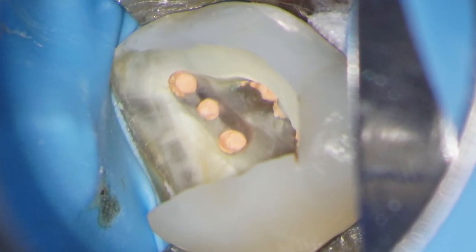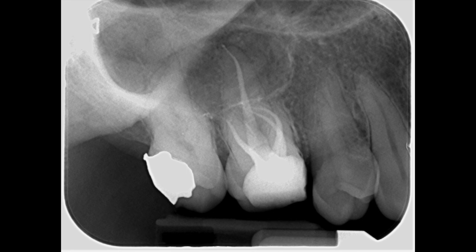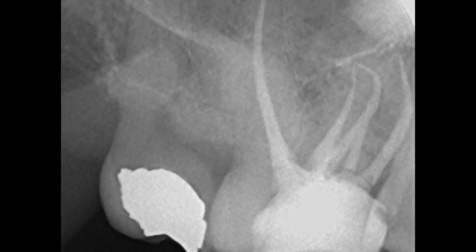Everything was obturated using a vertically compacted gutta-percha technique. Here you have the pre-operative radiograph showing the slightly sclerosed and moderately curved root canals in this maxillary right first molar. This is my post-op radiograph showing a good coronal-apical seal and a core build-up ready for crown prep. The distal angled view clearly shows the curvatures of these canals in the plane that you cannot visualize on a standard radiograph. I'll see you again soon and whatever you do, enjoy your endo.